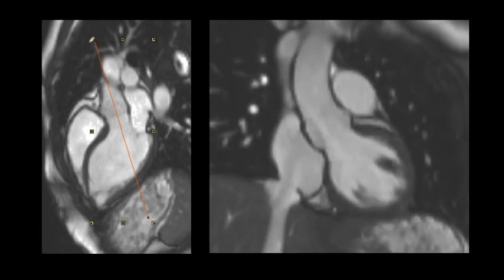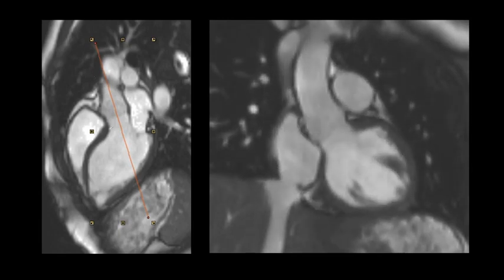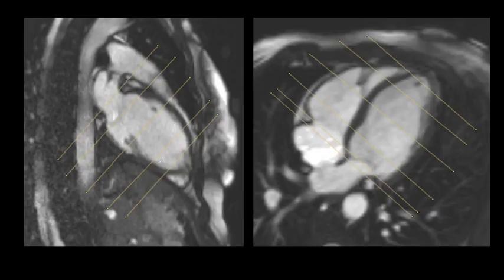The LVOT cross-cut is that you cross-cut through your LVOT view. Now to start our short axis cine, we will use the four chamber and we will use the VLA, the vertical long axis. Again, as we said, you start from the mid atrium, going all the way down to cover the apex.